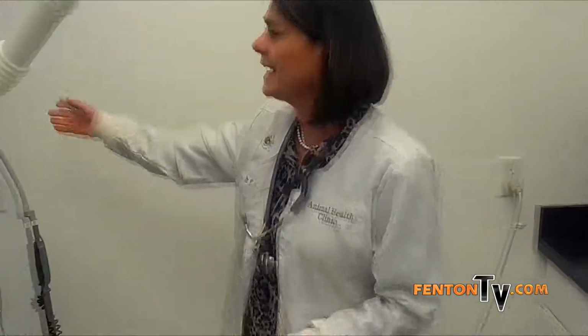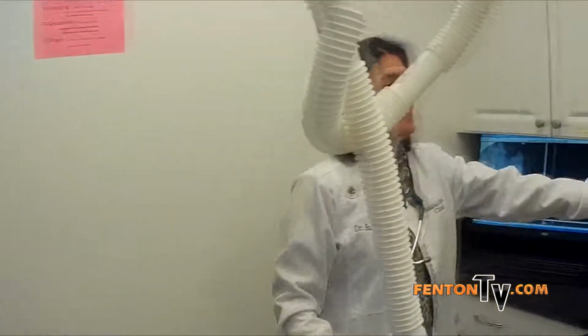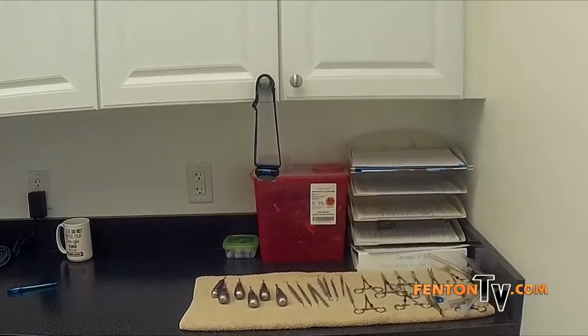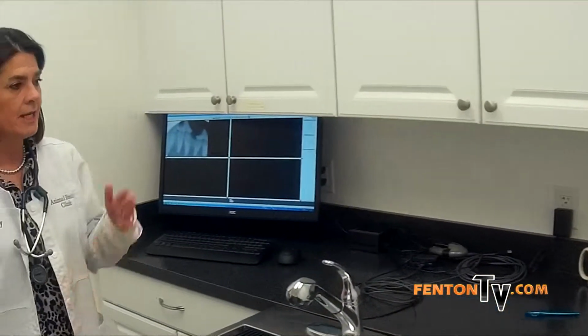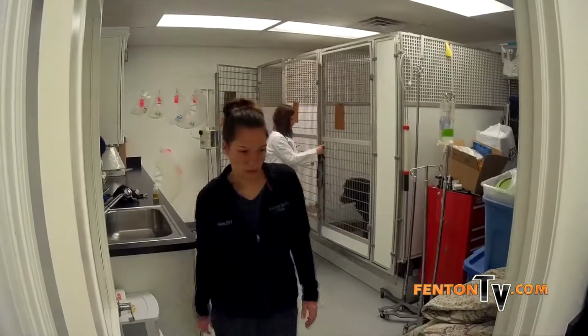We also have a dedicated light because we're working in a dark oral cavity. And we also have these funny little gadgets over here for magnification and increased light that we put on our heads, they're headlights, and we can look down in the oral cavity and get a better idea of what's going on.